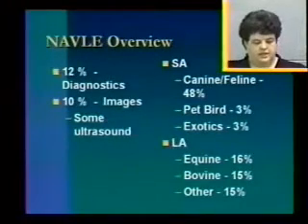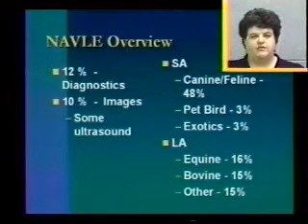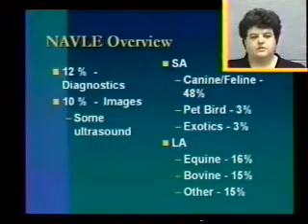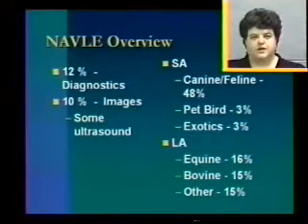So as you know, diagnostics cover about 12% of what's on the exam. Of that, about 10% are going to include some images. There has been some ultrasound on the exam, and on the test examination that's actually on the internet on the site, there are some ultrasound questions.